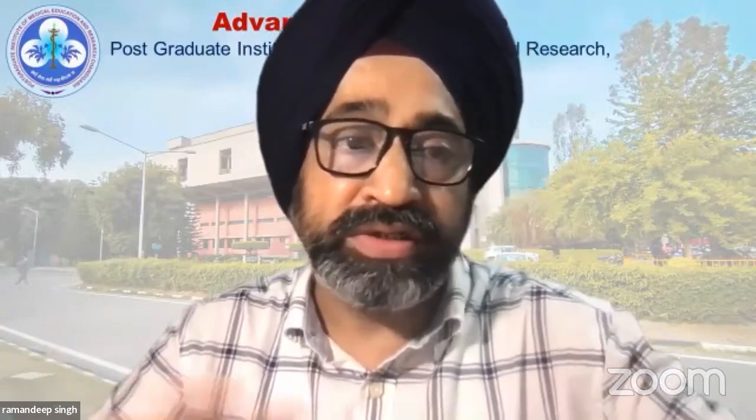Yeah, so I think what Dr. Jatinder has already said, I totally believe in that actually. If I have to really go for indices, my indices remain the size of the hole, how symptomatic the patient is, and the autofluorescence works a lot. So I don't want anything else in multimodal imaging. Just an OCT and autofluorescence are good enough to tell the patient prognosis, and they work most of the times in these patients actually.